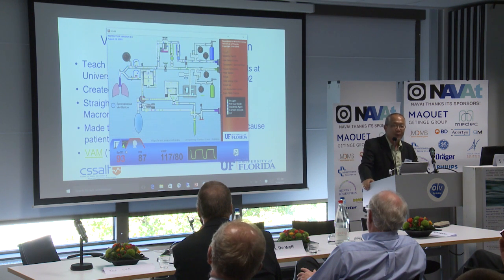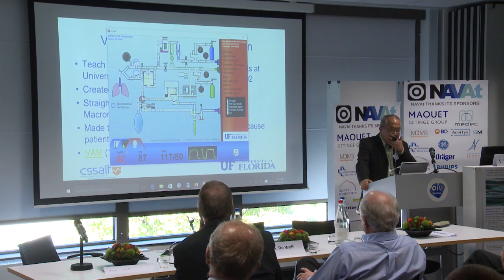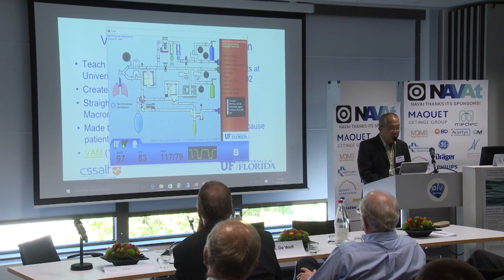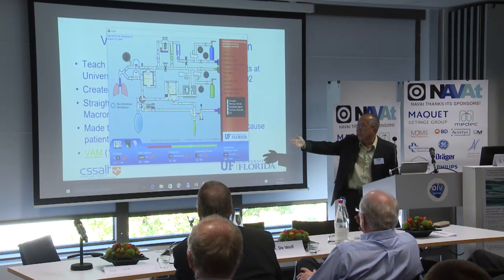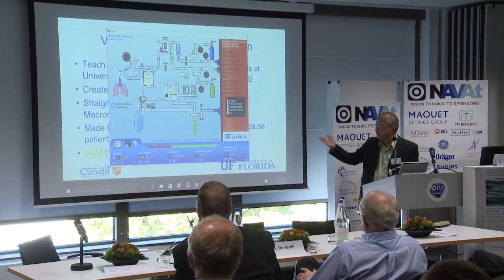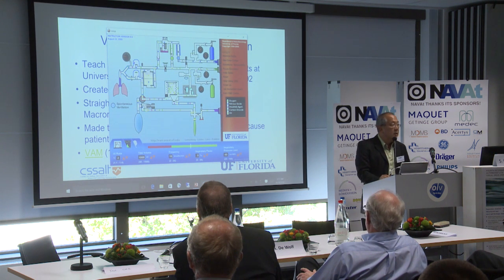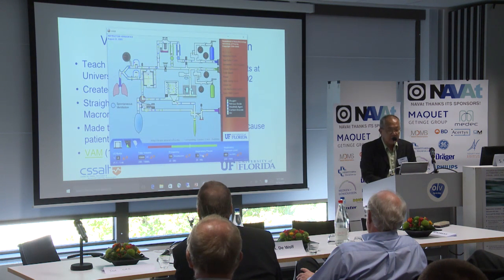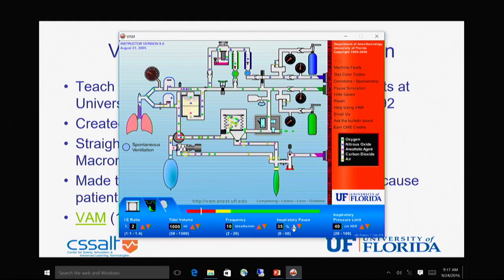This simulation keeps you on your toes. Now the ventilator is going, so I can chat a bit. That's the virtual anesthesia machine in a nutshell. I can adjust my APL valve and all the ventilator settings — I:E ratio, tidal volume, frequency, inspiratory pause, and pressure limit. In the bottom, it shows you the phases of inspiration. If I put on some inspiratory pause, you can see the pause represented in yellow. This helps you understand how what you're doing changes how the machine works.